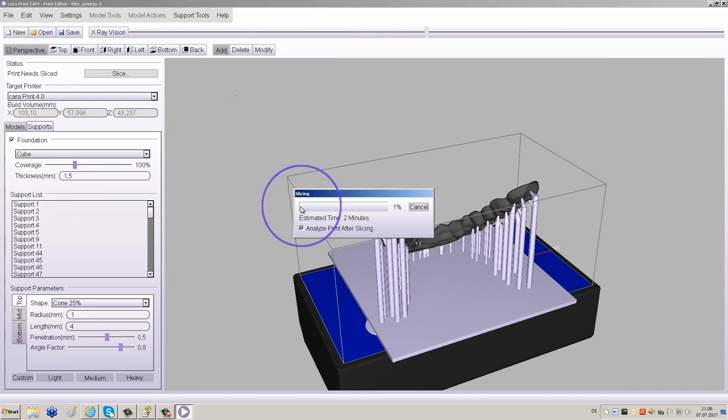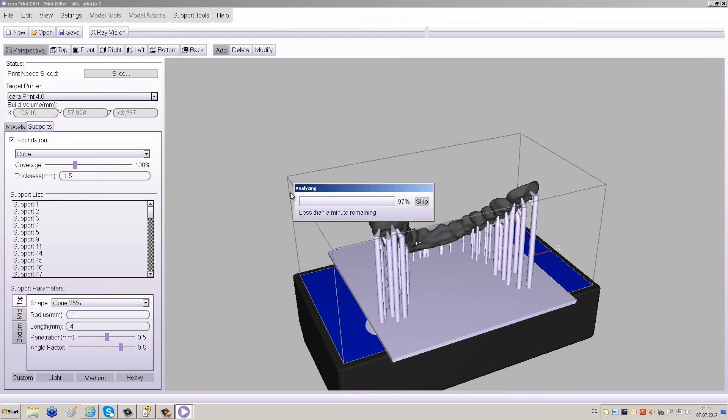The slicing process will begin automatically. After slicing, the results will be analyzed and saved automatically.